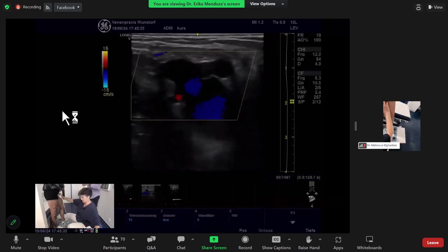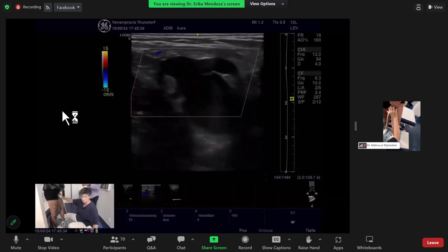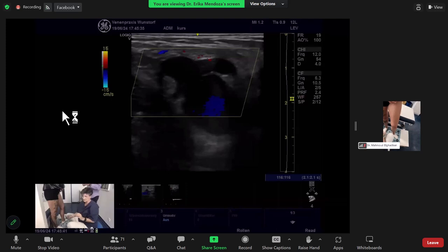It depends on the situation. In this case, I would do either surgical flush ligation of the tributary on the saphenous vein, or laser, because in both cases you're sure to close just where you want. If you put the foam, you risk closing all the saphenous vein because you can't stop the foam going up. If the vein was smaller, then I would consider ultrasound guided foam therapy. But this is a large vein.